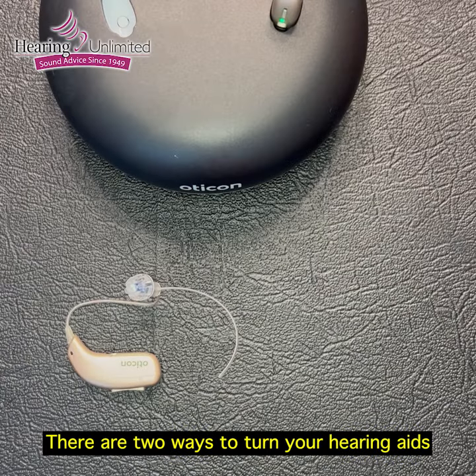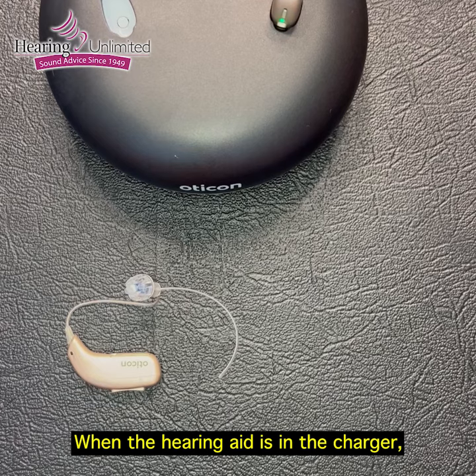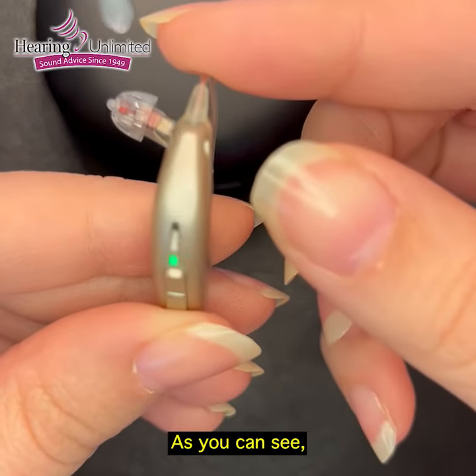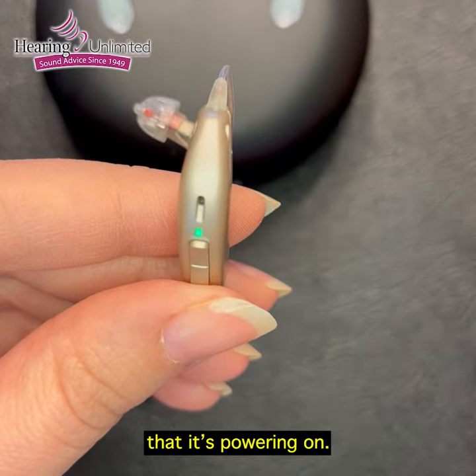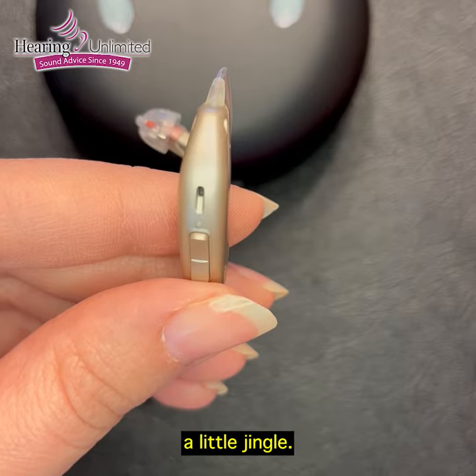There are two ways to turn your hearing aids on and off. When the hearing aid is in the charger and you take it out, it will automatically turn on. As you can see, there's a green light that blinks to let you know that it's powering on. If you get it up to your ear, you may even hear a little jingle.